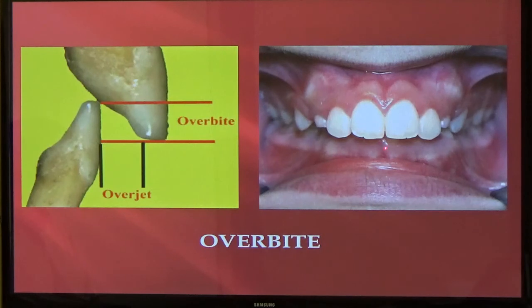Now he still has the overjet, so the overjet, we can't see it here. That's this measurement. So from here to wherever his back teeth are, you put the perio probe and measure that way, and that gives us our overjet. Question on overjet, overbite. So the overbite is just the vertical. Overjet is the horizontal.